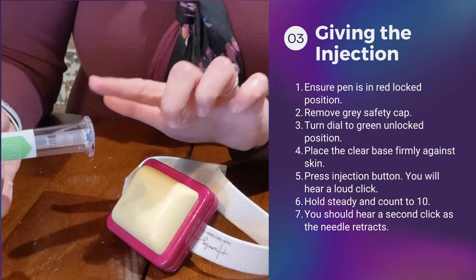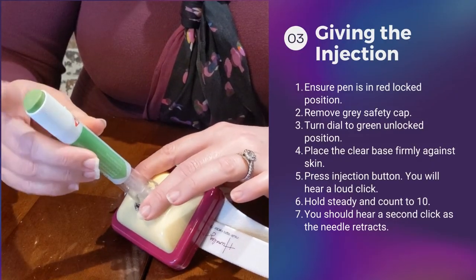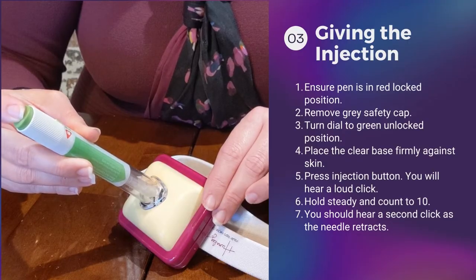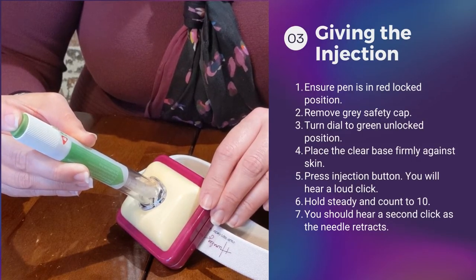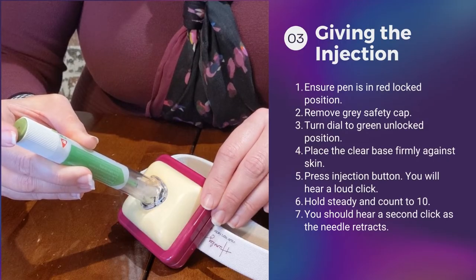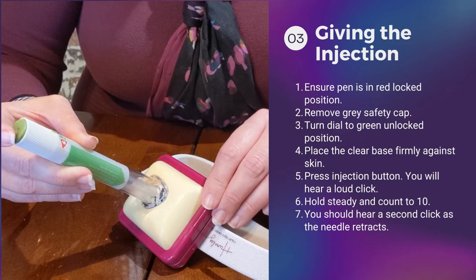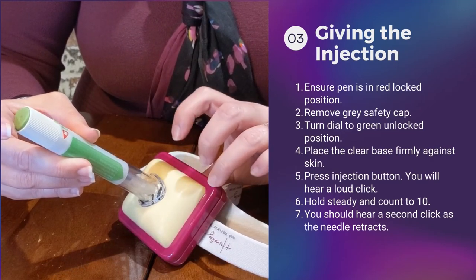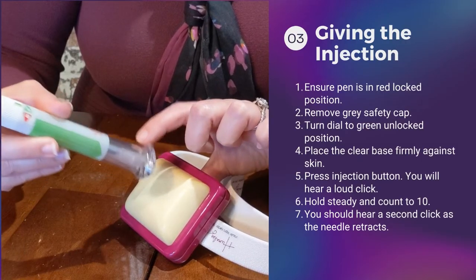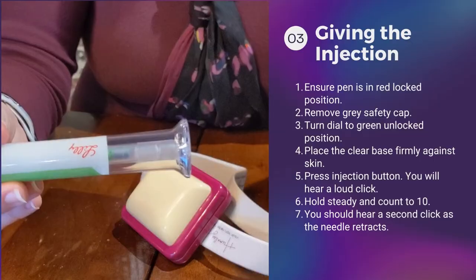At this point, we are going to put this clear triangle firmly up against the skin. Make sure you are pushing it against your skin and press this green button — then you're going to hear a click. You want to be sure that you hold this here for at least 10 seconds. After you press and hear that click, I want you to count to 10. Once you either count to 10 or hear that second click, look in the dosing window that we talked about. You should see that gray stopper, and that tells you the dose is complete.